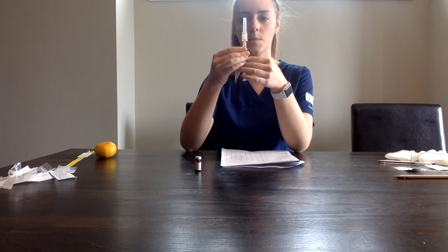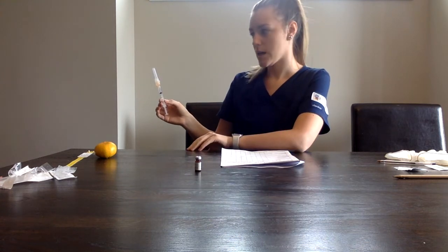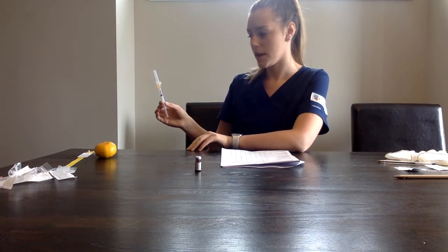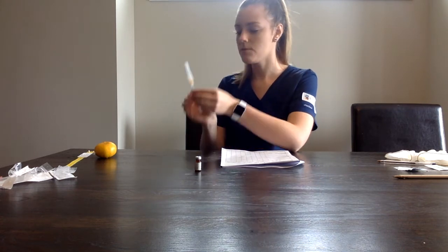Okay, so we're at 1 ml, there's no bubbles in our syringe barrel, and I see there's a bleb at the top of the med. So we'll get the two nurses to double sign and double check the medication volume and dose. Okay, so they verified it, they said it's okay to give.